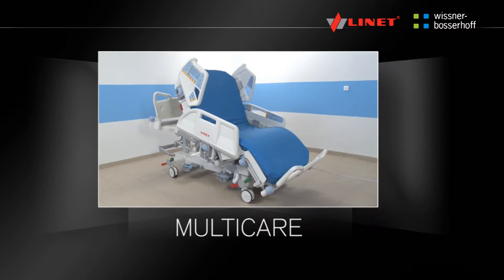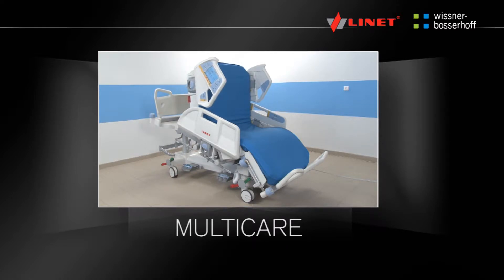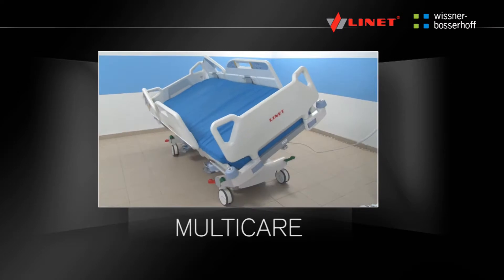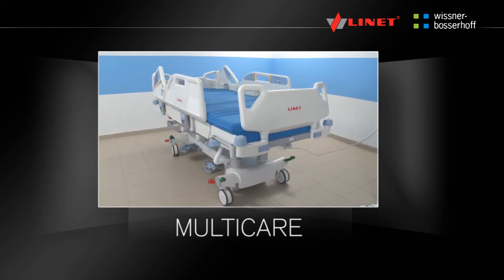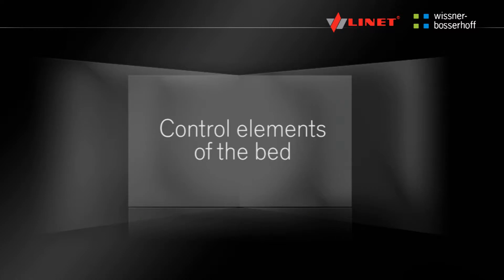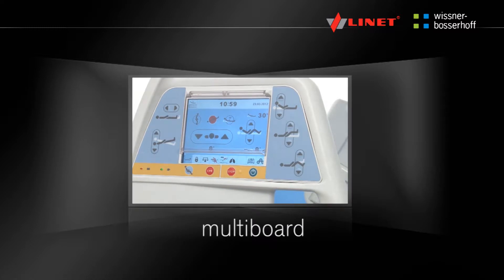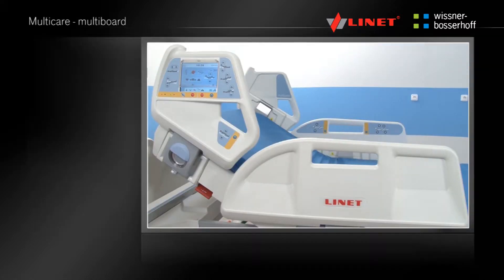The purpose of the video manual is for showing how the product should be used. The video manual does not replace the standard instructions for use in any way. Always read the instructions before use. For a detailed description of the functions, see the chapter on electrical functions of the bed.